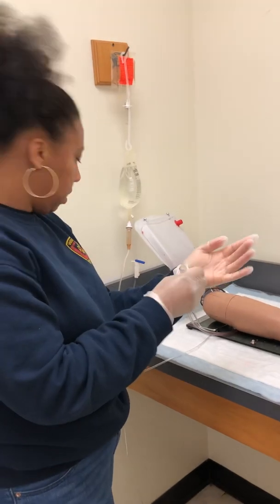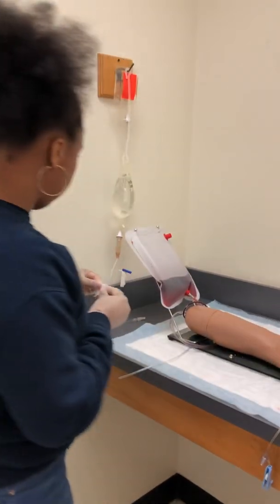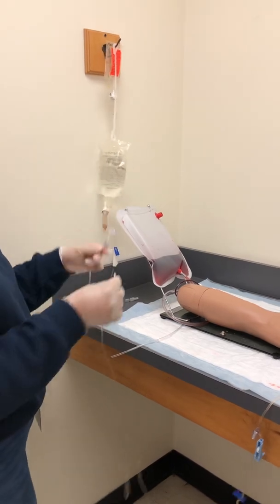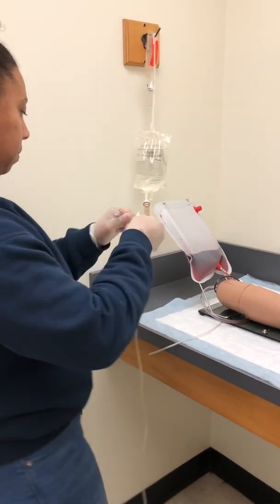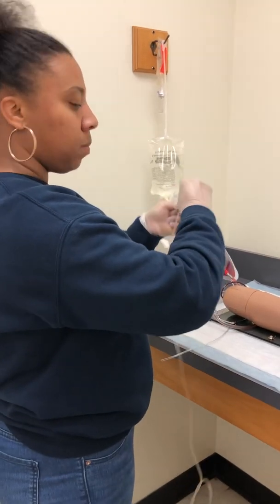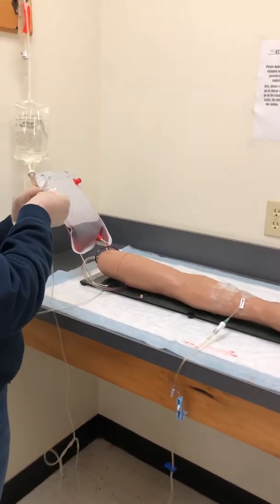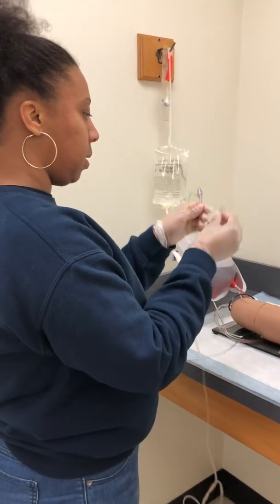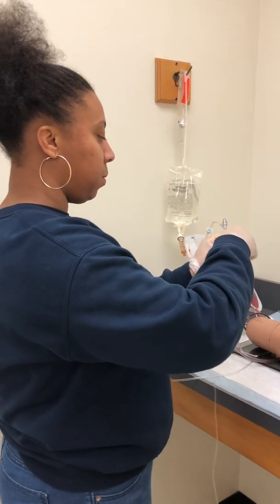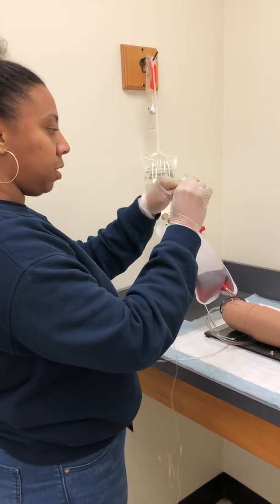Okay. I would clean my hub. All right, and I would clean the hub closest to the bag. Clean it for about 15 seconds. All right, dispose of that. Then I would take the cap off without touching it so I don't break sterilization. And then I would insert it.